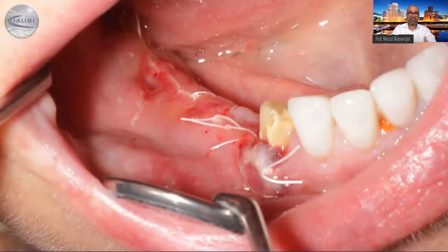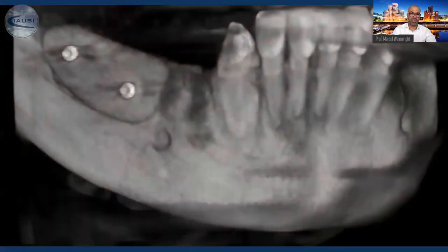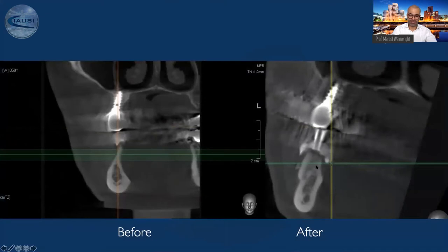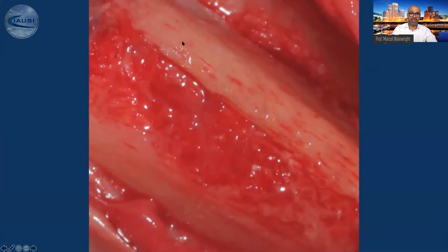Mandatory here is very good primary wound closure so we don't expose the grafted area. You can see the mental nerve, the buccal plate of the bone block, and a little of the latch remaining. After four months the patient returned. We take out the screw — this is before, this is after — and this is what I want to obtain: the buccal plate completely incorporated with the recipient side, spongy bone showing nice bleeding, very vital bone, and here is the lingual plate. This is what I want to achieve.